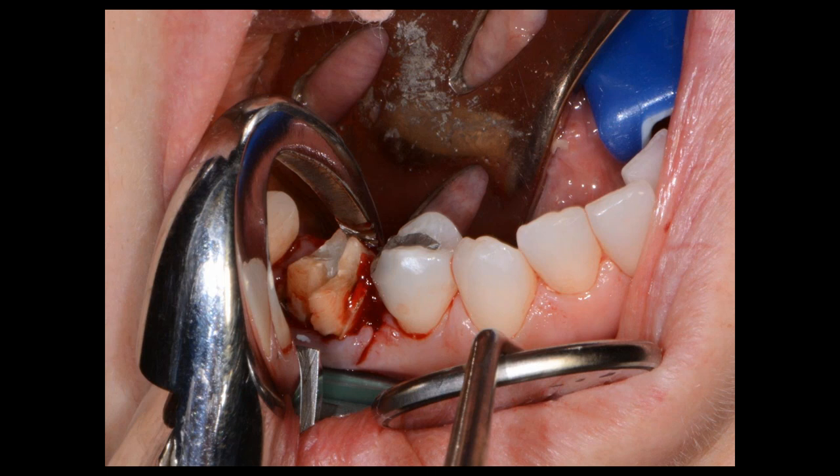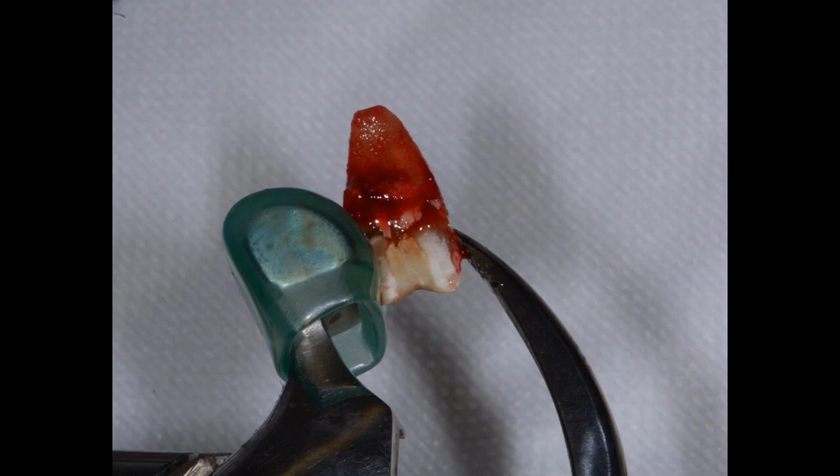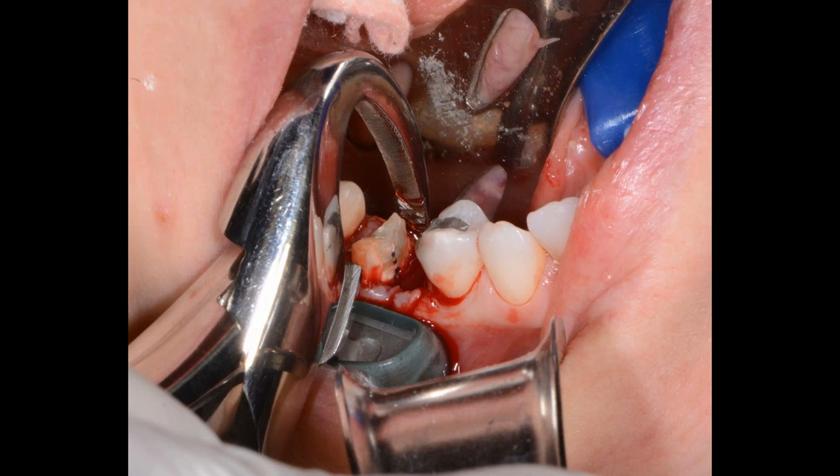And here you can see the rotational movement that I'm using with only wrist action. And you can see the mesial root is already starting to evulse from that socket. And so here we can see we've removed the full mesial root. We're going to do the same thing with the distal root. Apply the beak of the physics forceps on a tooth structure, solid tooth structure. Place the bumper as apical as possible into the vestibular area. And then without squeezing hard, just rotating that root out of the socket using the bumper as the pivot point.